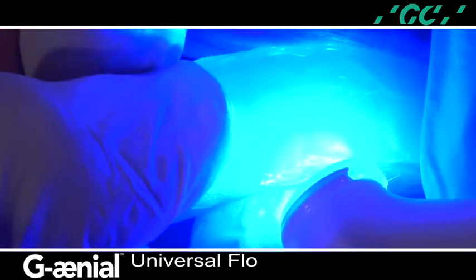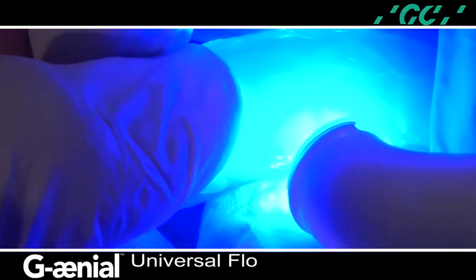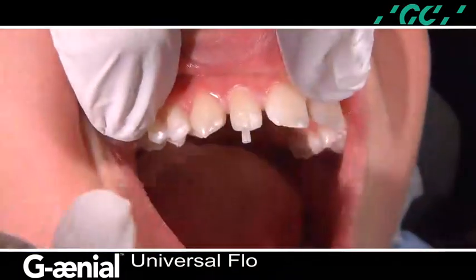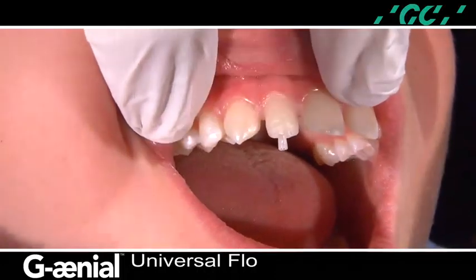The composite resin is light cured through the clear resin matrix for 40 seconds from the facial and 40 seconds on the occlusal lingual. The clear silicone matrix is removed. Notice the optimal biointegration of the flowable material with the tooth structure.